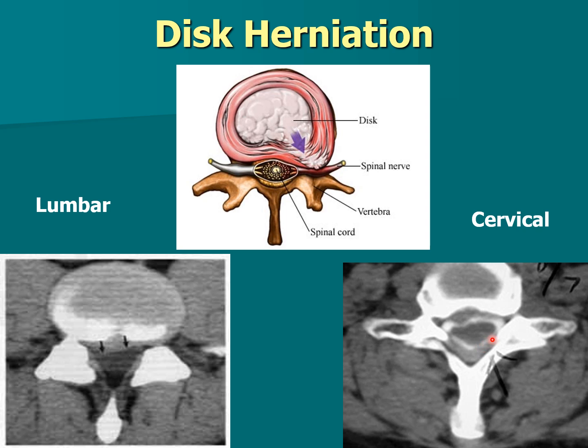Here we have given contrast, because you can see that CSF in the spinal fluid, and the cord is going to be wider and thicker up here. It's going to occupy more of the space, and so here we can see a herniation of the disc. See how this is blipped in here? It goes down here. That's a disc pressing on this spinal canal. So that's an indication of a herniated disc. It makes it much easier to see when you have the CSF here. Some of this stuff over here is that ligamentum flavum that we were talking about, the connective tissue. This is that ligamentum flavum here, that area right there. That is not disc.